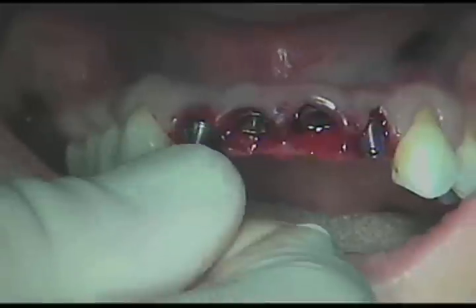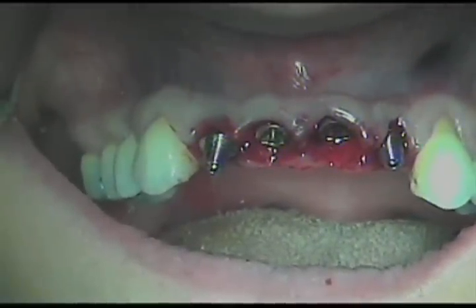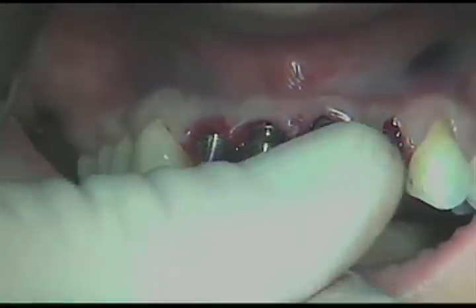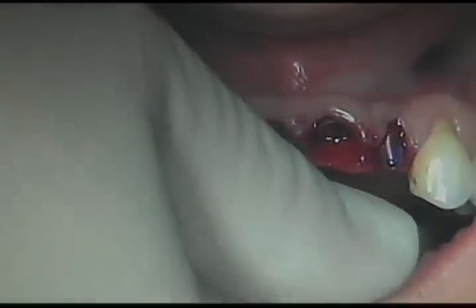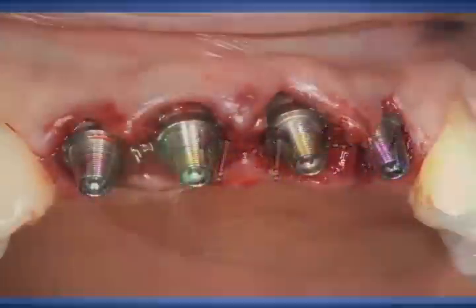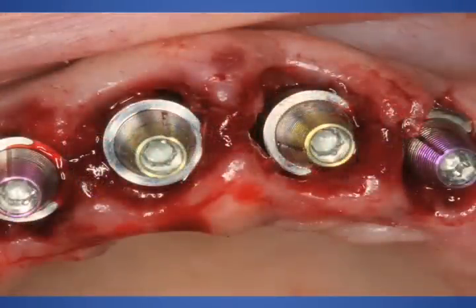We're going to place the transitional abutments in position. They're conically shaped, so it allows us a little bit of flexibility of the transitional splinted crowns. Close-up view, and you can see there's no sutures here, and this is immediately upon implant placement and seating of those transitional abutments.